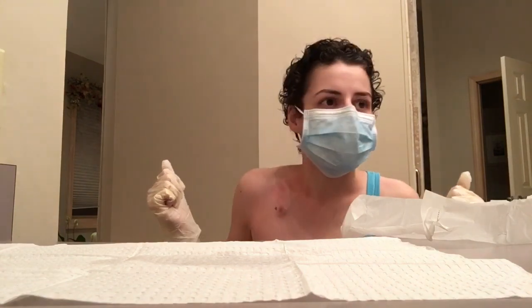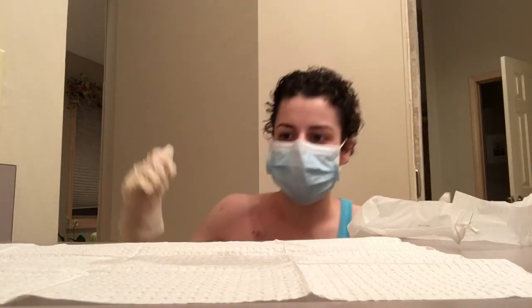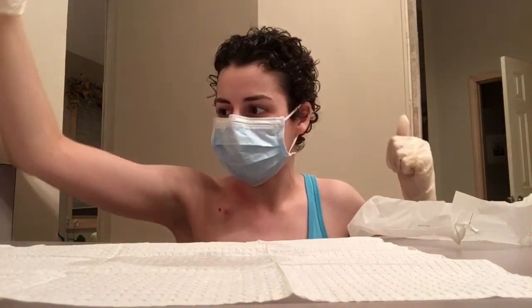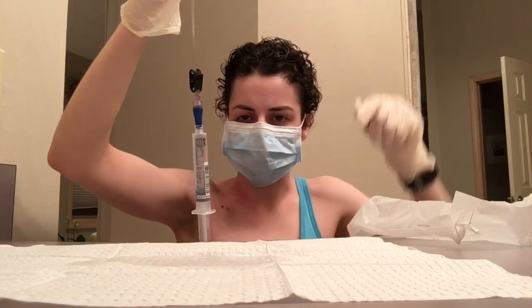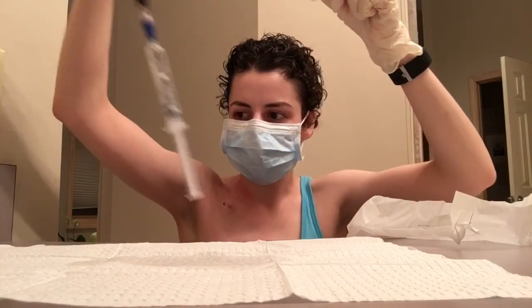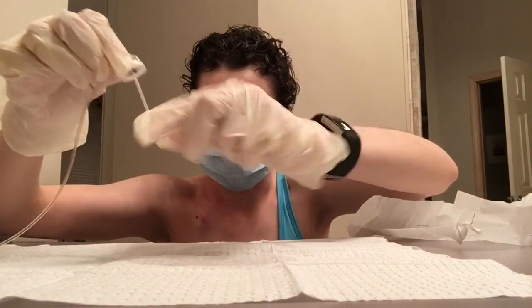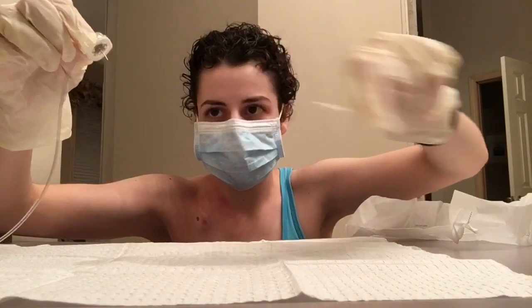All right, I'm just gonna lean towards the mirror and it looks dry, and it feels dry. I want to make sure it feels dry as much as it looks dry. So now this is hanging out here in the sterile field. This is not sterile, the saline, so that's not hanging out in the sterile field. Bring it to the side, and I'm taking off this little plastic thing so I'm not pricking myself.